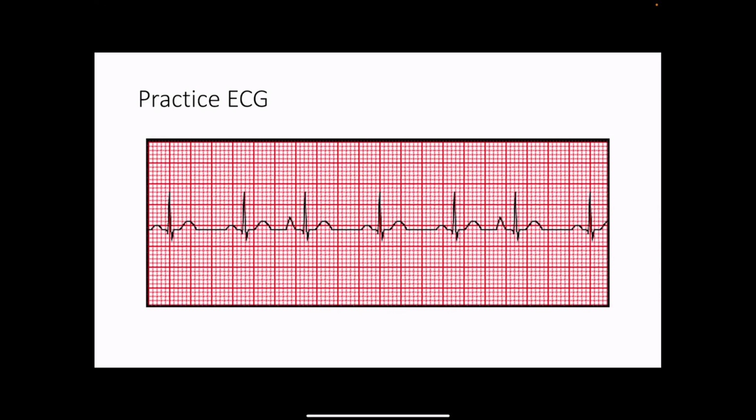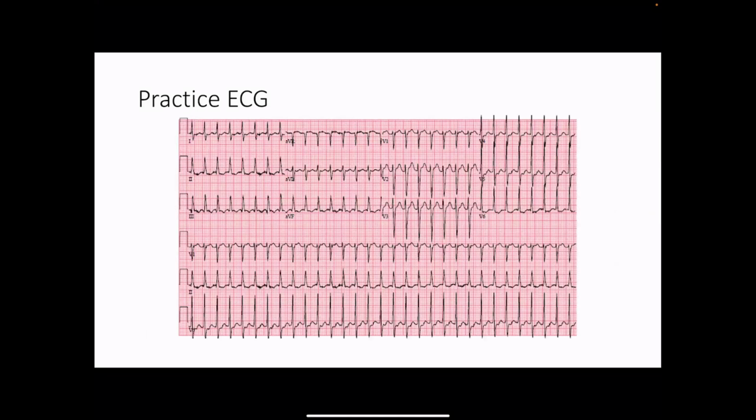Premature atrial contraction. Exactly. If you notice, this one is coming in too soon. This is regular, regular, regular, regular. It looks very regular, and this one is coming in a bit too early, and it has a P wave. So there is atrial contraction. So this is a premature atrial contraction. Okay. What about this one? SVT. Exactly. No P waves, and it's more than 150, SVT. Okay.